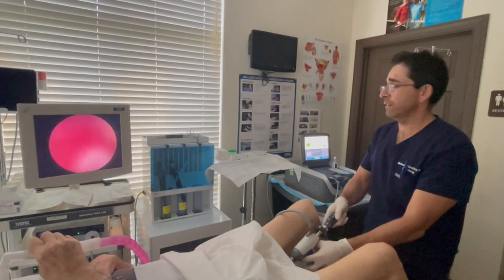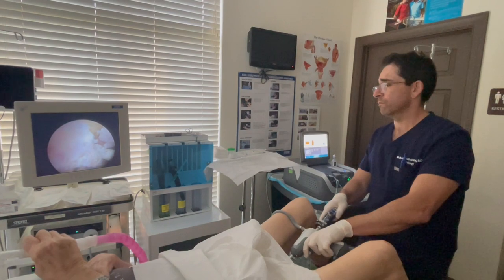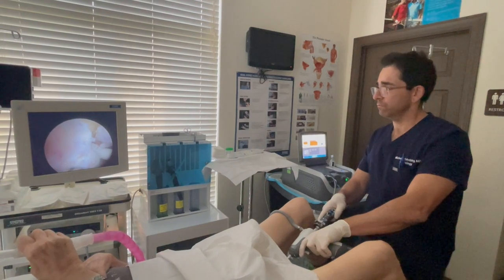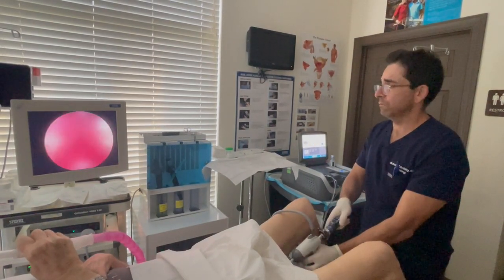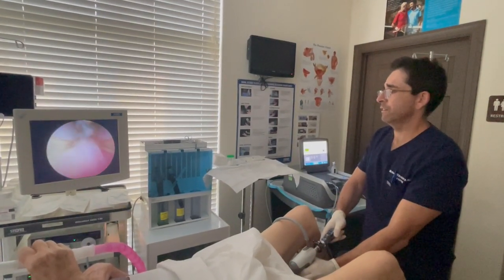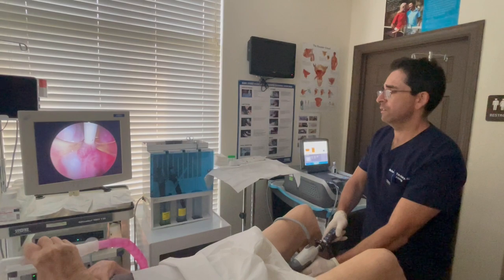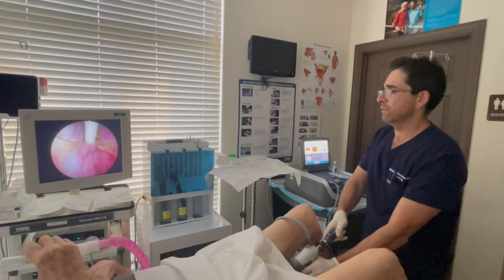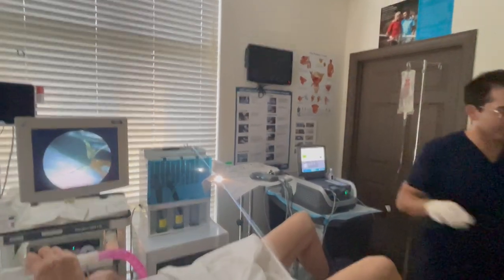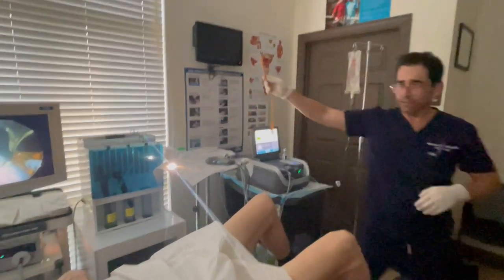Let's put on this other side here. So now we're doing really good. We'll do one little treatment right on the median lobe here. I think we'll do five seconds there. He's good. So we'll put the catheter in and we will get him going.